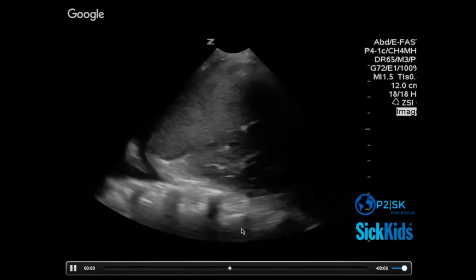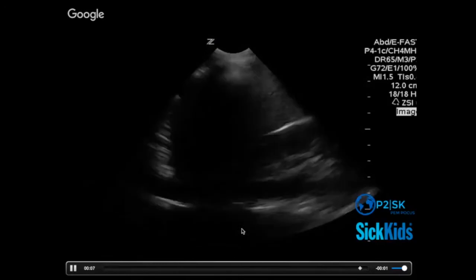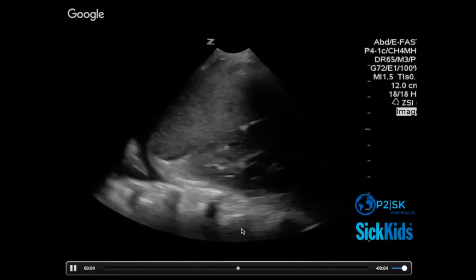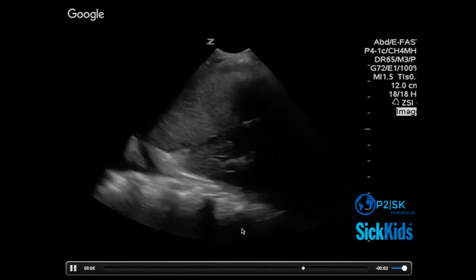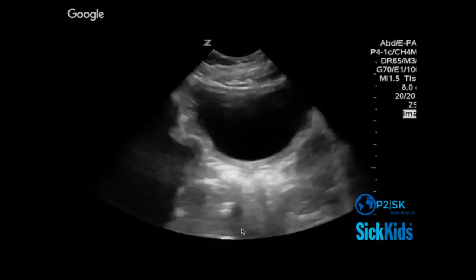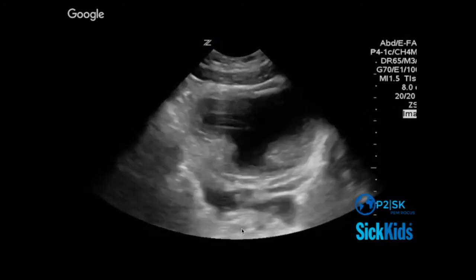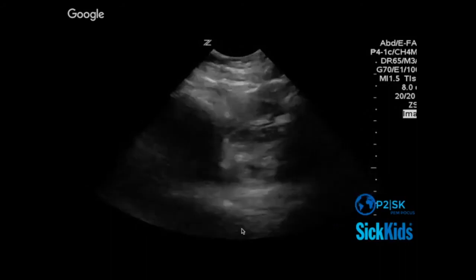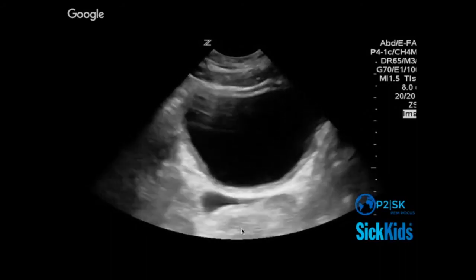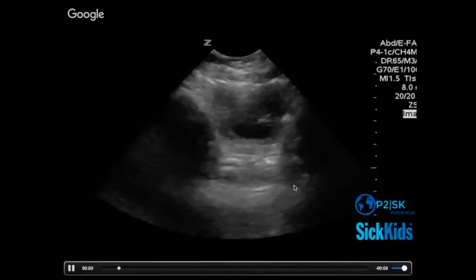Does that change anything for you? Do you think this patient now has had abdominal trauma? No. We'd think they'd probably have capillary leak, right? So it wouldn't be that surprising if we saw free fluid in the abdomen. Which, when you go scan their pelvis, everyone appreciates the behind the bladder, this bow tie-like appearance of free fluid.